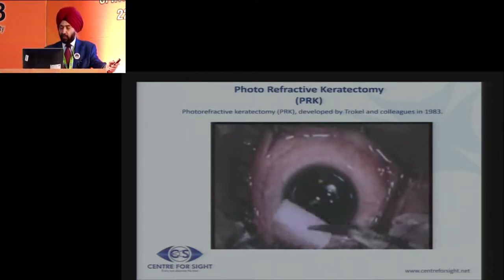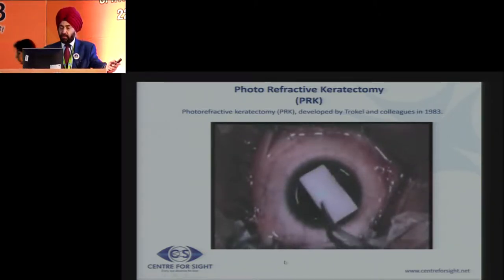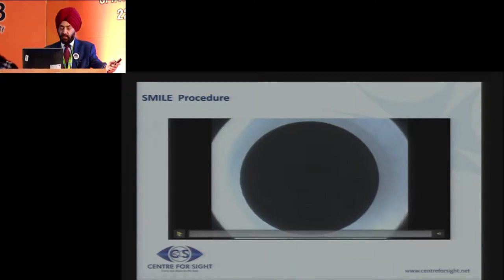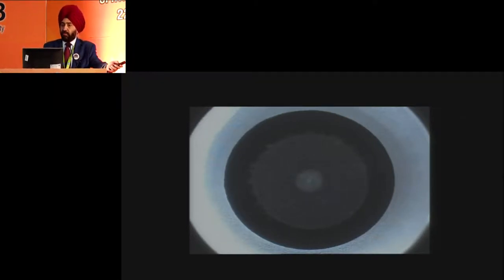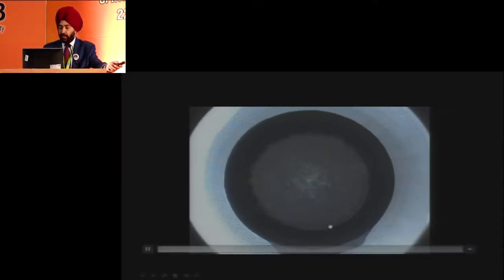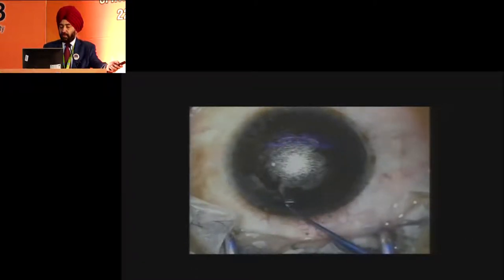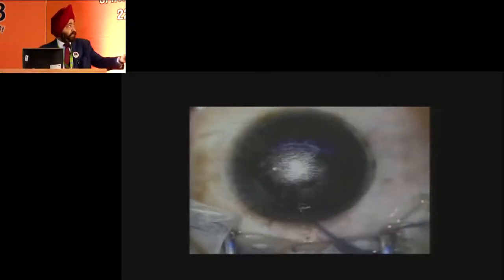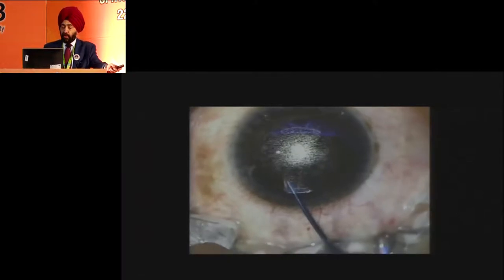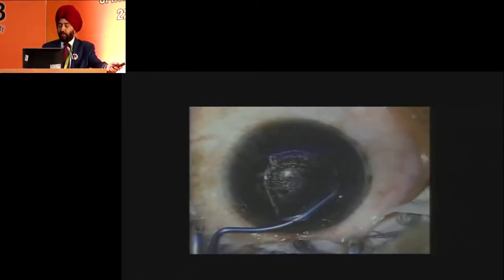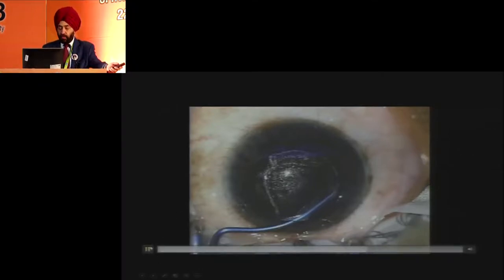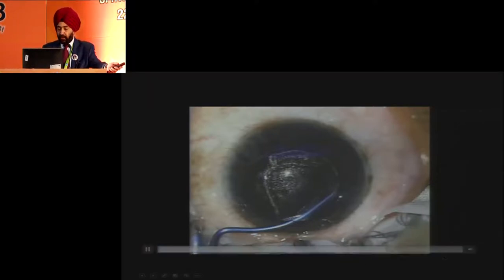A bandage contact lens is placed after surface ablation. The second procedure is SMILE — using only the femtosecond laser. The first pass creates the undercut of the lenticule; thickness depends on the power being treated. The second is a 360-degree cut creating the cap and side cut. After this, using a blunt spatula, you separate the top part of the lenticule from the cap. We don't call it a flap — it's called a cap. Then you go to the undersurface and continue with removal until the lenticule is taken out.